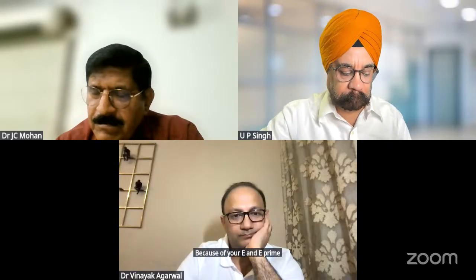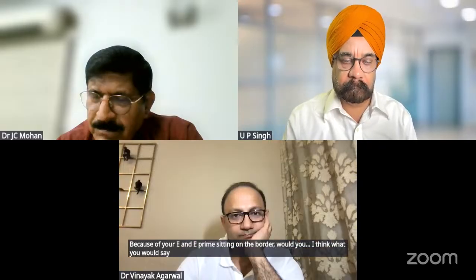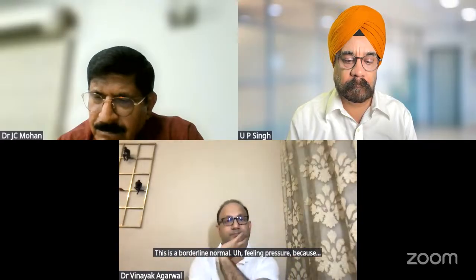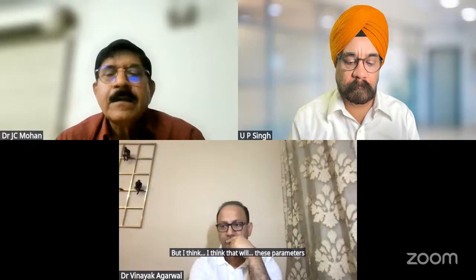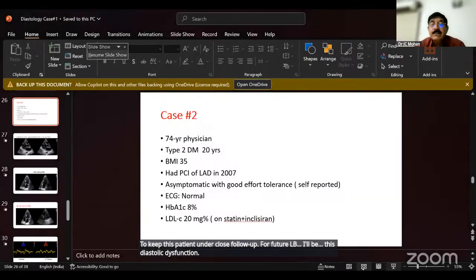Because your E and E prime are sitting on the border, I think what you would say is that this is a borderline normal filling pressure, because just a little bit on the other side would be raised filling pressures. But I probably think that these parameters will raise concern to keep this patient under close follow-up for future diastolic dysfunction.